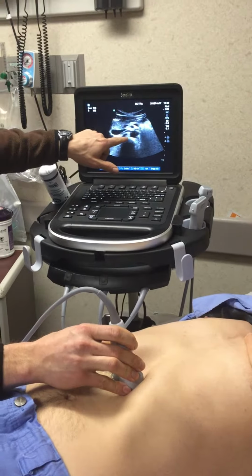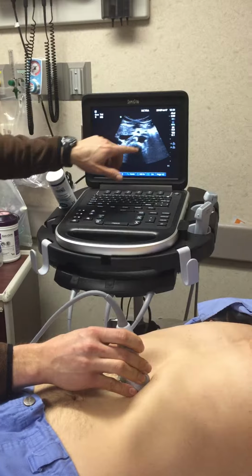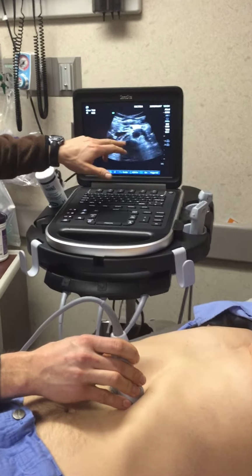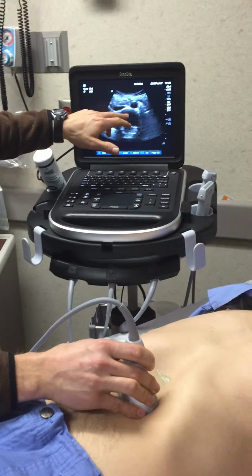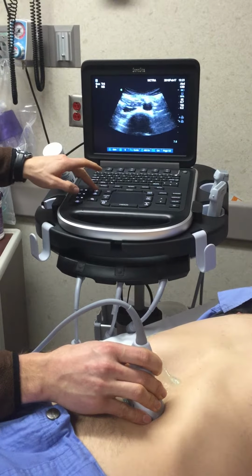You ideally will see the spine shadow here. There's your pulsating aorta. So you want to be able to freeze and measure at this point. But then also you can basically hold pressure and go down, following distally to the mid-abdominal aorta. You still see the large spine shadow. You can adjust your depth as needed.